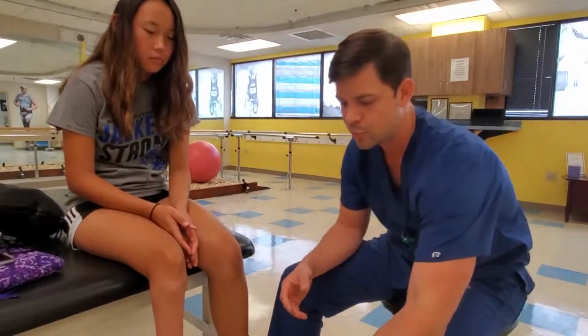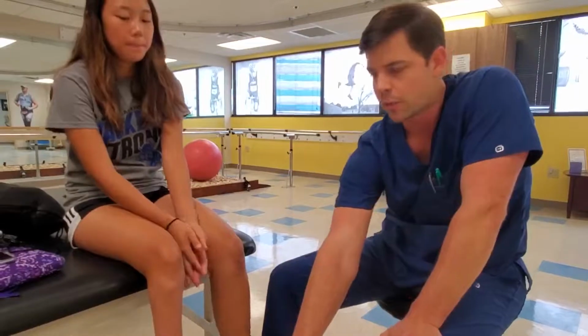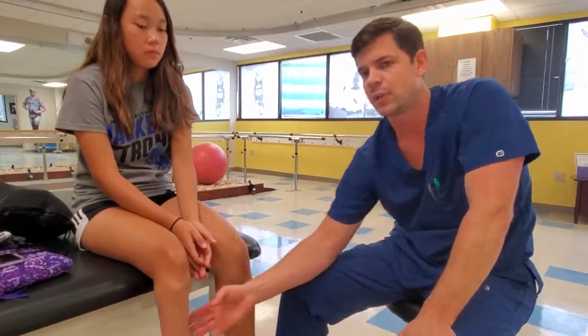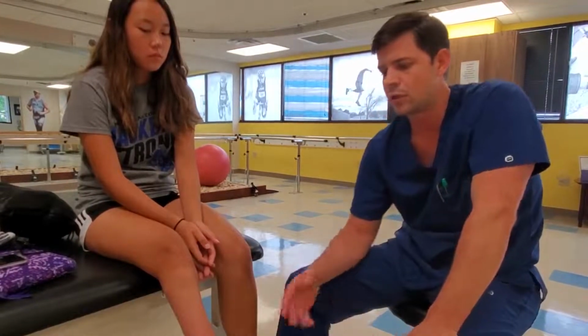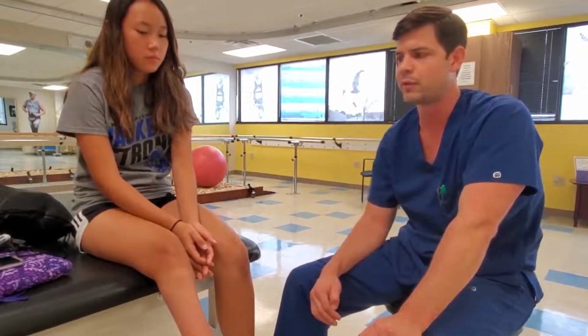She has this new prosthesis that we're dialing in, and to make sure what we're doing here is right, she's gonna be wearing this setup for about 6 weeks to 2 months to make sure she doesn't get any more skin irritation on the posterior aspect of her leg here. And then if all is good, we're gonna finish it out with another running blade, doing the same kind of suspension method we have here.